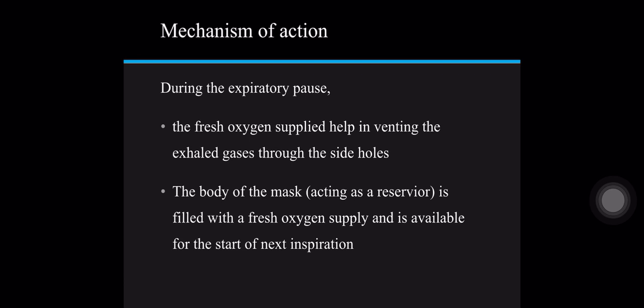This is also very important in the mechanism of face masks. During the expiratory pause, the fresh gas supplied helps in venting the exhaled gases out of the side holes. The body of the mask is filled with the fresh oxygen supply and is available for the next inspiration.